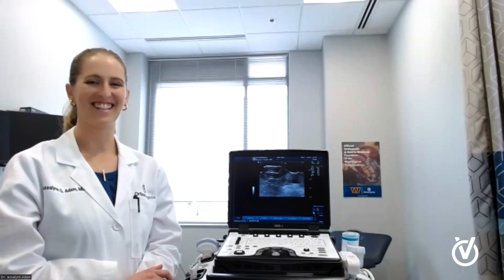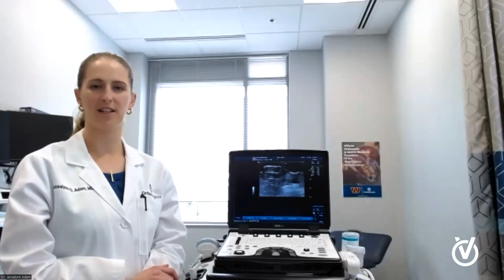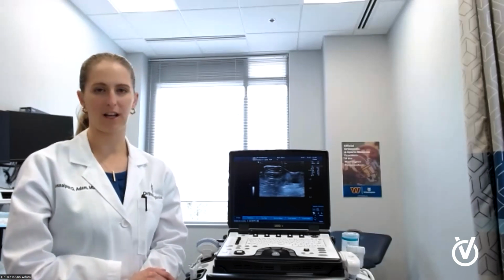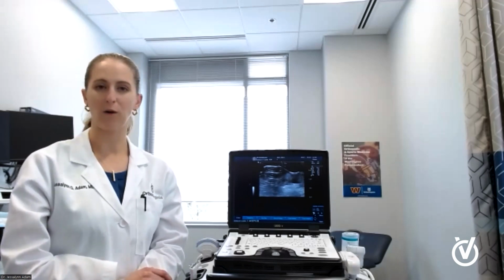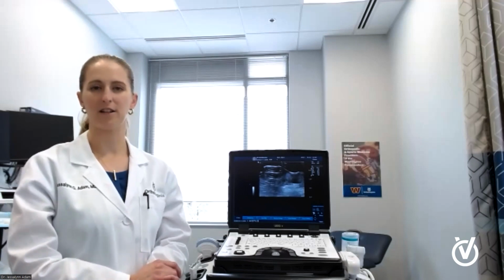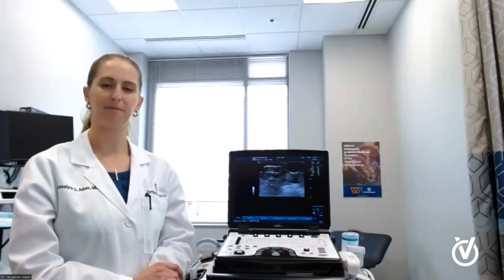Thank you. Can you get an ultrasound if you have metal in your body? Absolutely. In fact, ultrasound may be more advantageous than some other imaging in that scenario because, for instance, an MRI, you'll see a lot of metal artifact, and there are ways to reduce that, but ultrasound can complement that nicely. So for instance, say you have hardware in some part of your body and we're trying to evaluate if that's causing pain or discomfort or irritating the surrounding tissues. Ultrasound is a really nice option to look at that area.